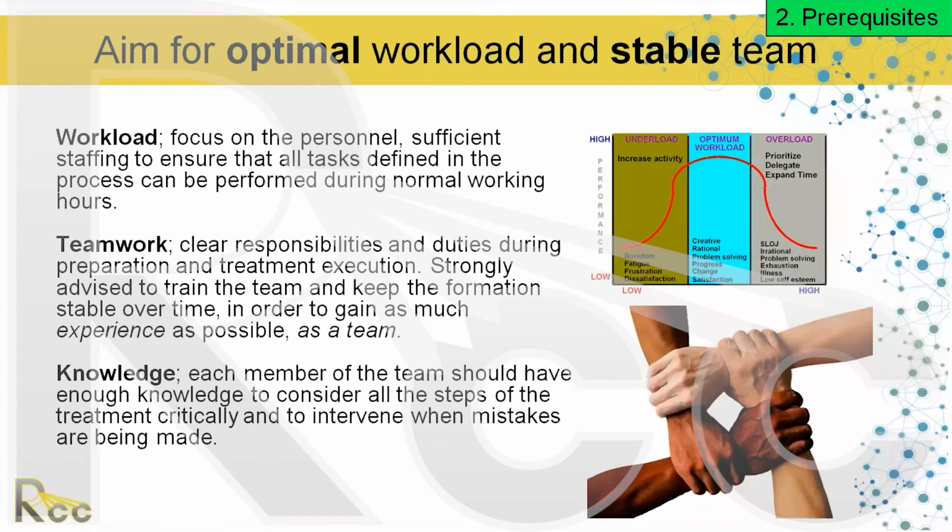These are some organizational elements in terms of getting it right. There is an optimal workload, and like I mentioned, you don't want to be doing too few cases that you're not fully engaged and you're not getting the experience, and you don't want to be doing so many that you're fatigued. There's a balance to be had, and I understand financial constraints in terms of staffing, and also you've got the patients you've got, but be mindful of these things. Be mindful of the fact that there is an ideal workload. Too little or too much can lead to failures, and if you're in one of those danger zones, just be aware. That's the way to protect against it.